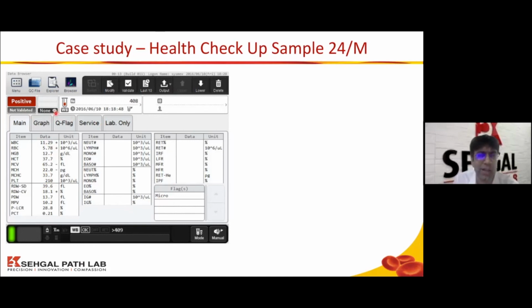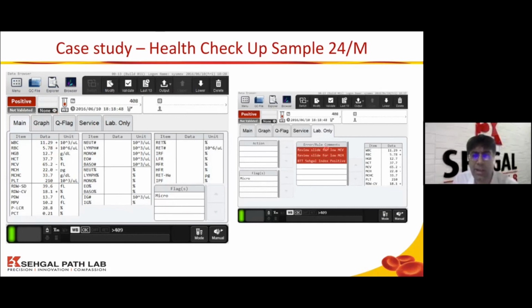Which tells my staff that there is a lab defined slide review rule to be alerted. Please click on this tab to see more. When they clicked on this tab to see more, it said, review the slide for low MCV, MCV is 65. Review slide for low MCH, so they go back, yes, the MCH appears 22. And it said Sehgal index positive, which is one of the THAL indices for screening which you have put.